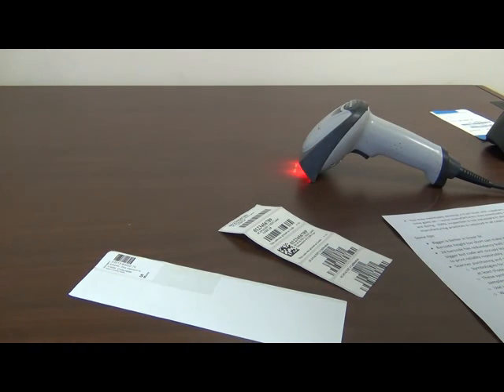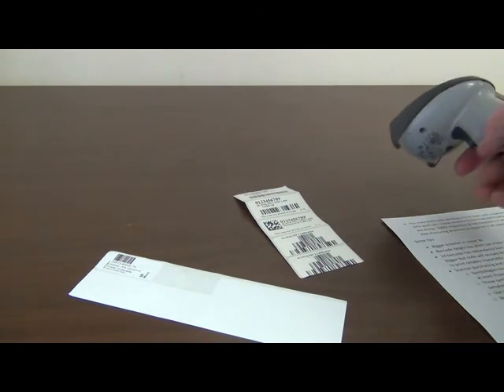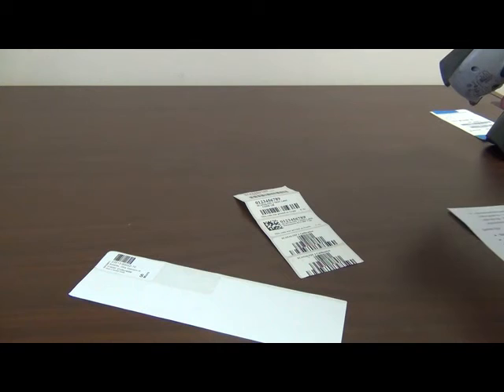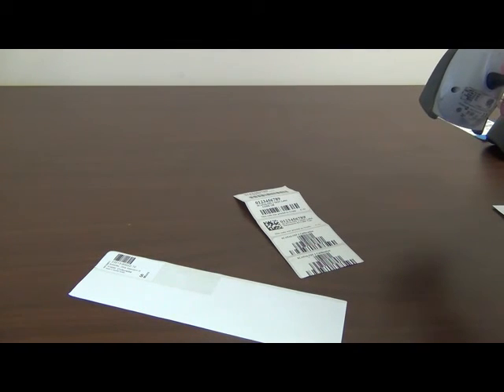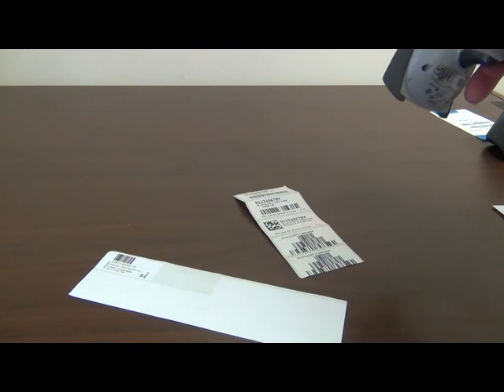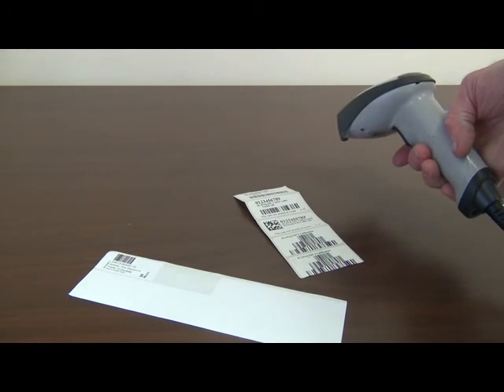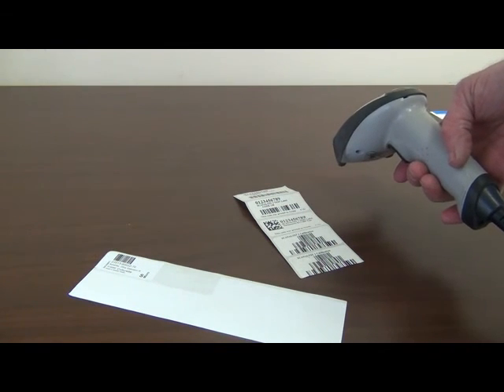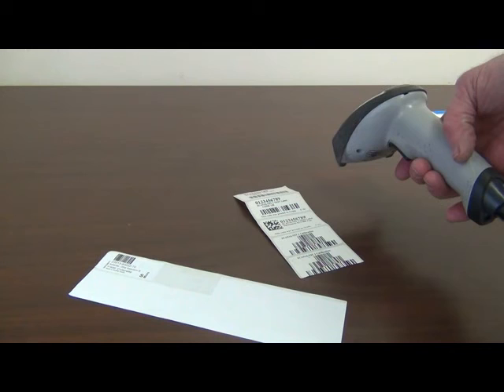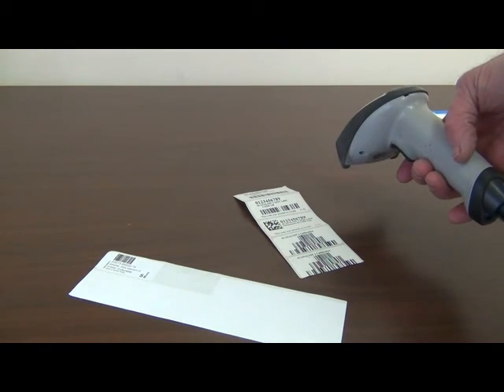And I talked about the two symbologies that are used in healthcare, and the reason I did was because these scanners typically have somewhere north of 40 various symbologies built into them. And it's good to turn off the ones that you don't use.